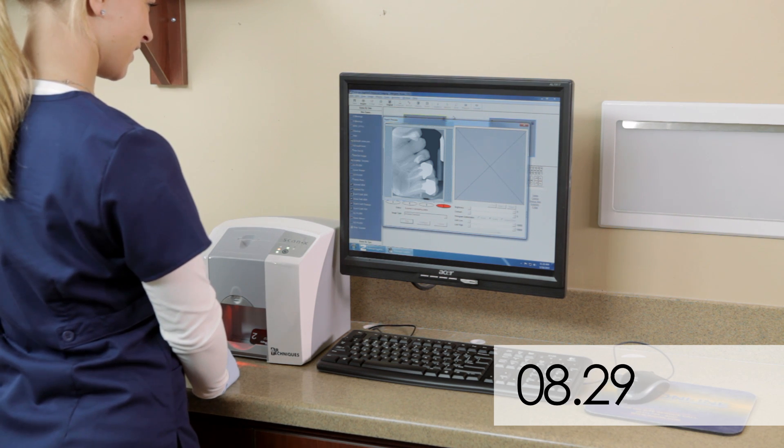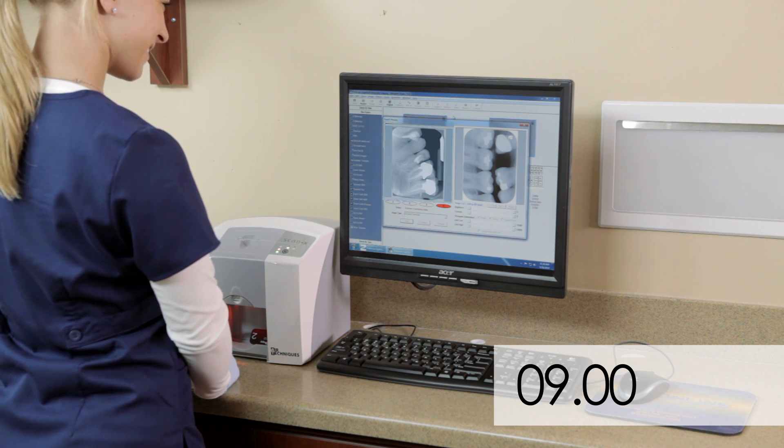And now, only 9 seconds after inserting the sensor into the unit, your image is ready.